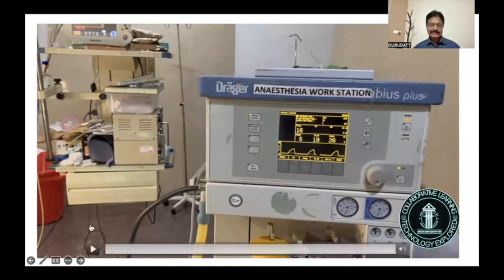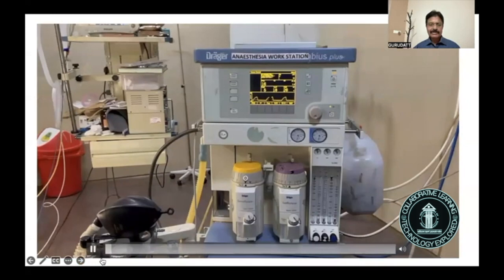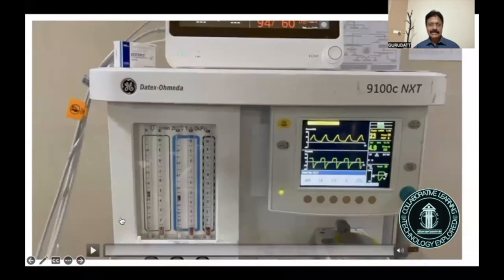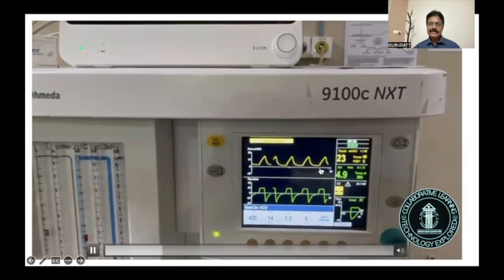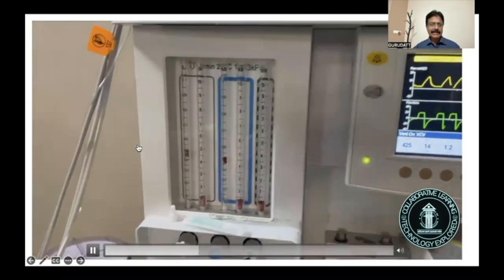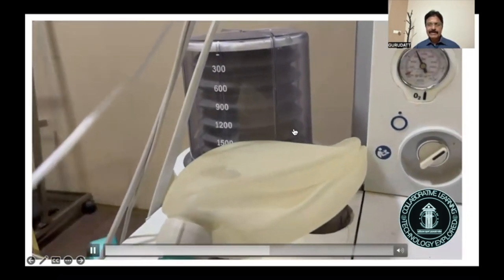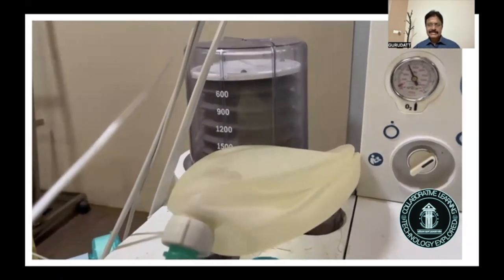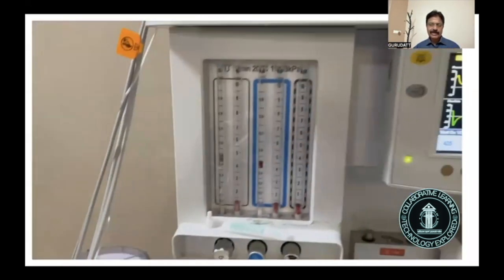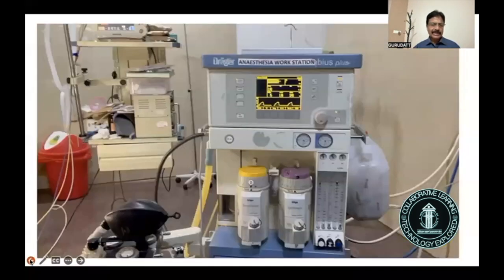Now we'll see the difference in a GE workstation, where we don't have the decoupling valve. This is a GE workstation 9100 NXT. You can see here also the patient is on mechanical ventilation. And here the ventilator is of a bellows type. In this bellows type of ventilator, the bag is totally disconnected from the closed circuit. That is the reason why the bag will not be moving at all during inspiration or expiration. So this is quite opposite to the Draeger ventilator.